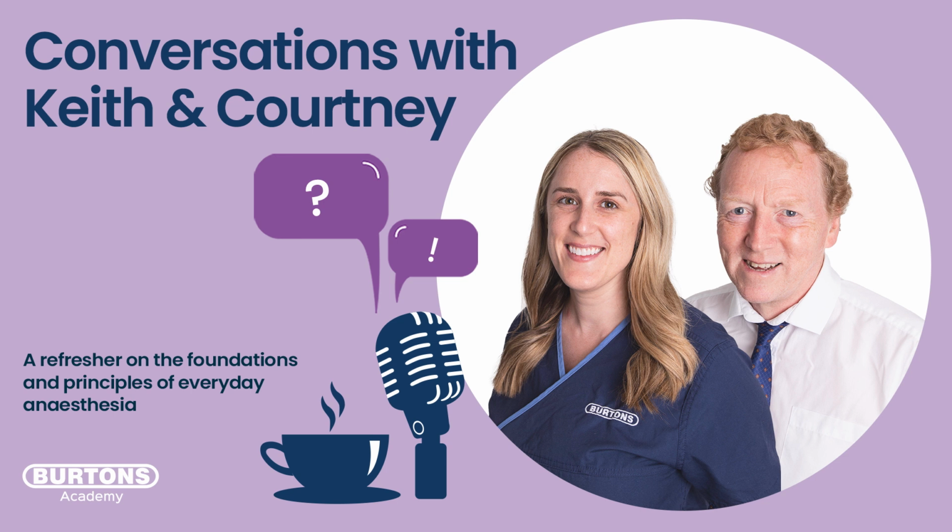And people will talk about time constants for circuits, and you need 5 time constants to make a change. But of course, it's not just the circuit, as you just said, it's the circuit plus the patient. So if you've got a 30 kilo Labrador, you've probably got 1 liter or more of FRC, functional residual capacity, reserve lung capacity, which adds to the circuit volume of the apparatus as well. So it can take quite a time, and that's why you need that period.